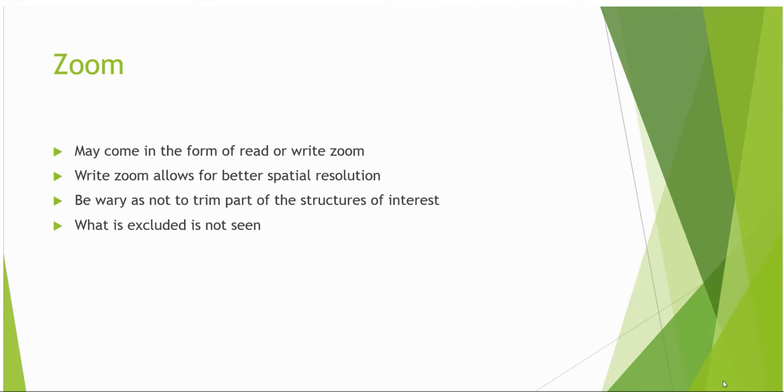The main disadvantage is if the box isn't properly applied, then part of the structure of interest may be lost. Additionally, if there is pathology outside the zoom box view, this could be missed during the exam, as the sonographer may not have been focusing on the entire image when the zoom box is applied. In summary, for a good clinical exam, we should apply zoom where possible to keep frame rate and image quality high, with the understanding that any pathology or structures outside the box may not be seen, particularly if performing a panning motion.